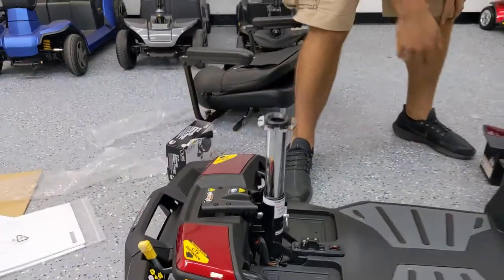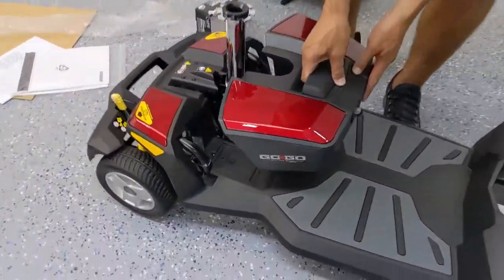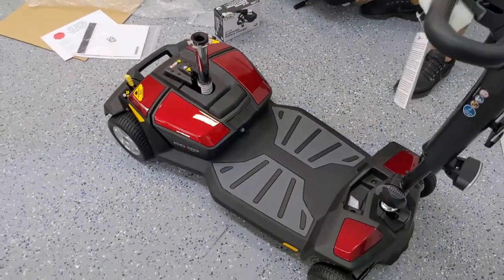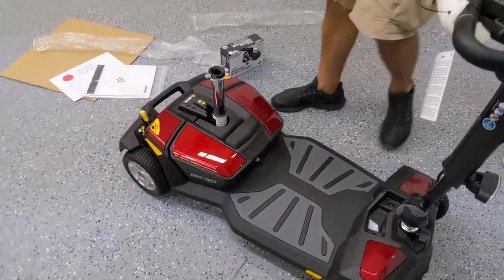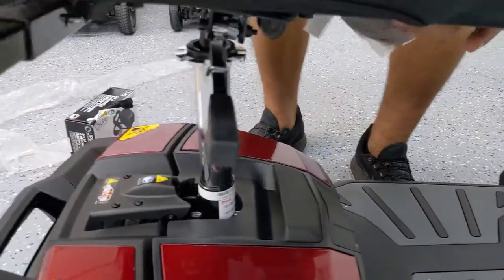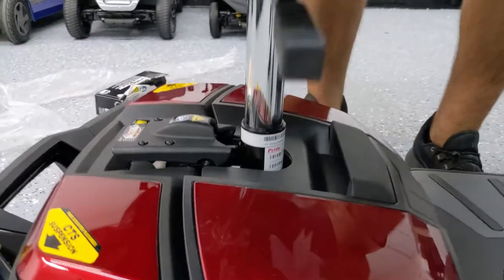Next step: take the battery box by the handle. Remember, keep it level when you're dropping it in. Last but not least, grab the seat, get the male connector lined up, drop it in, and let it just level itself out and slide in.